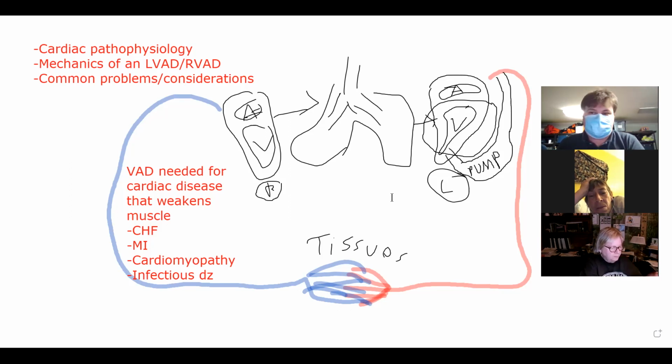Dick Cheney. Dick Cheney is probably the most memorable person that we can think about when it comes to ventricular assist devices. If you ever look at a picture of him, and I encourage you to, Google him right now, you will see a picture of him with the two shoulder straps with a battery pack on either side and a drive line that goes underneath the skin and connects to the ventricular assist device. It's a pretty impressive thing. And then he wound up getting a heart transplant. So that was a bridge to transplant type therapy.